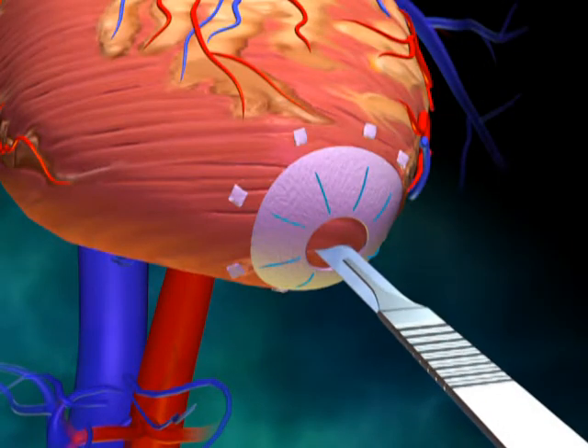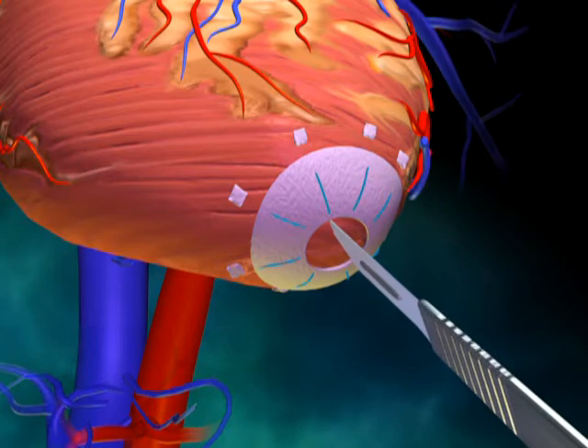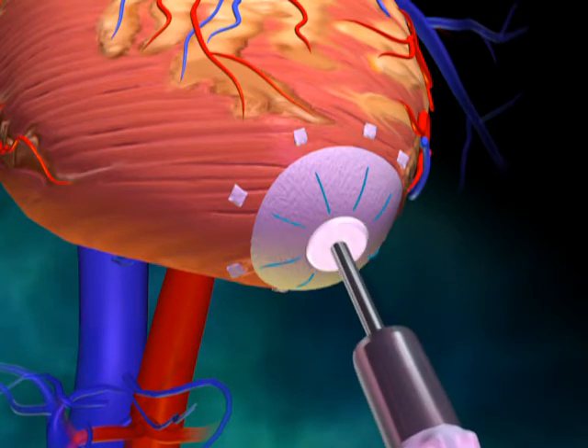With the preparatory work complete, a full thickness cruciate incision is made within the apical ring, and the coring device is utilized.